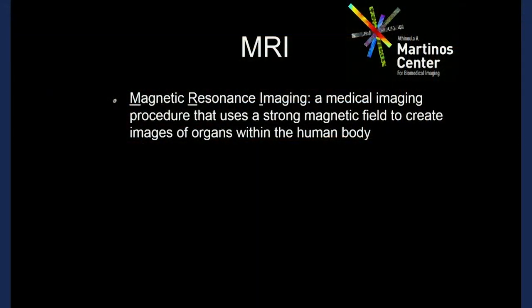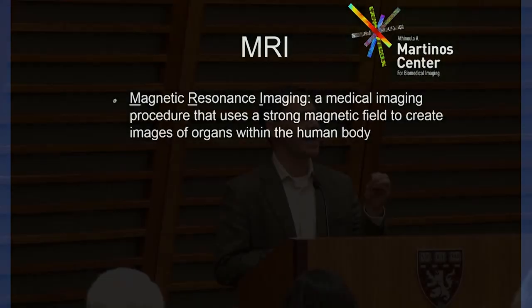So MRI. Anyone in the room been in an MRI before, had an MRI? A whole bunch of hands up. Okay, good. Now hold your hands up. Do you know what field strength you had the MRI at? No? Nobody. One person? 3T. Thank you very much. So this is the thing I want to tell you about. MRI stands for magnetic resonance imaging. But if you take one thing away from my talk today, I want you to remember the strength of the magnetic field matters. And I'll show you why.